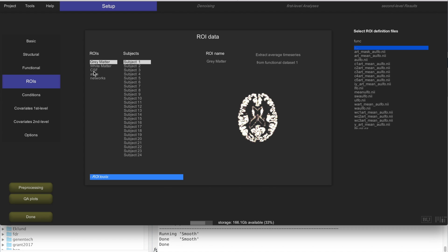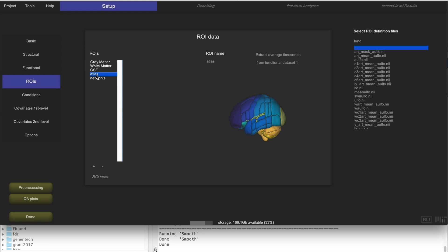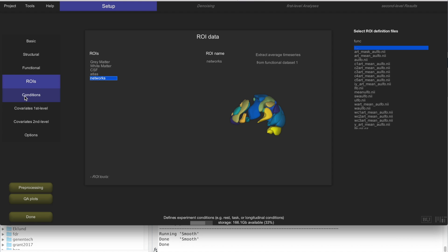The same applies for white matter and CSF. There are also other ROIs that come by default in CONN: a set of Harvard-Oxford Atlas ROIs, and a set of networks derived from independent component analysis. These are not subject-specific — they are in MNI space as well. This is the first thing added by the preprocessing steps: these three tissue masks.